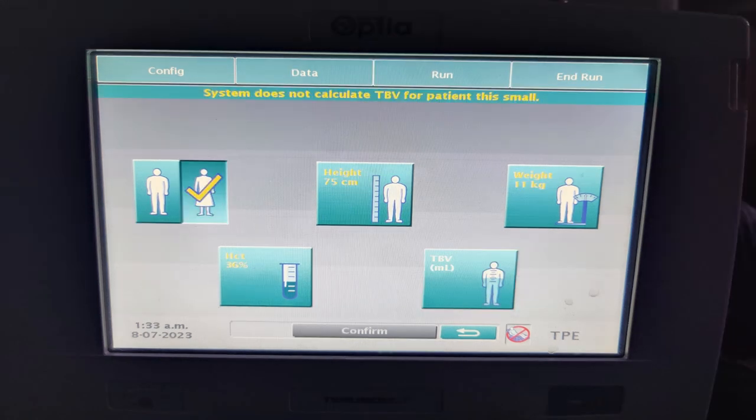In this case, it was a 1-year-old female child with a height of 75 cm, weight 11 kg, and hematocrit 36%. The system will not automatically calculate TBV like it does for an adult.